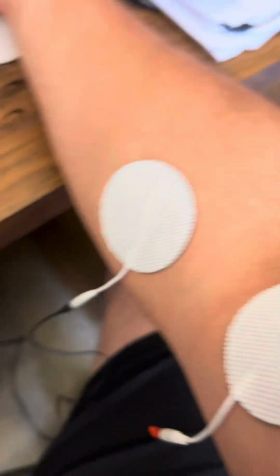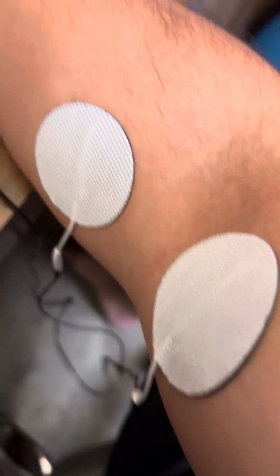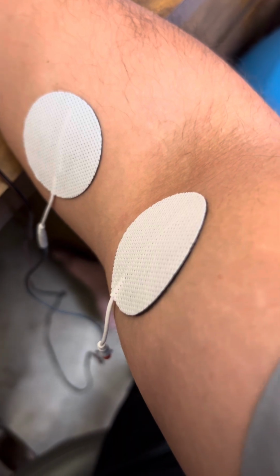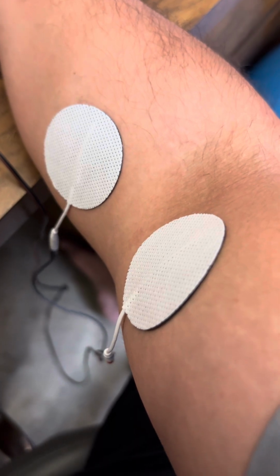So I'm gonna go ahead and place that on me really quickly. I'm gonna go ahead and place you down here real quick. All right, so that is how you place the electrodes in there, right? And you want it to be across, right? Just how these are right here. You don't want it to be right next to each other either, right? You want it to be that the central area of pain be right in the center as well.